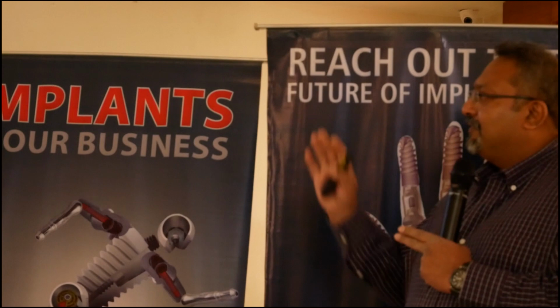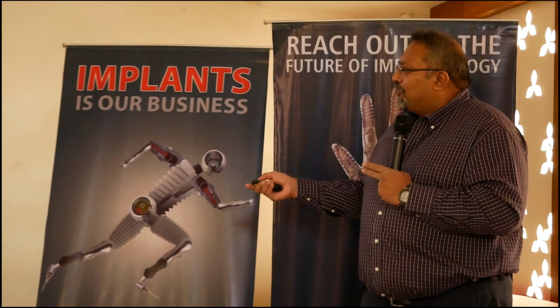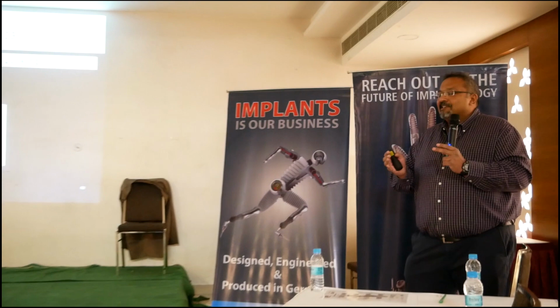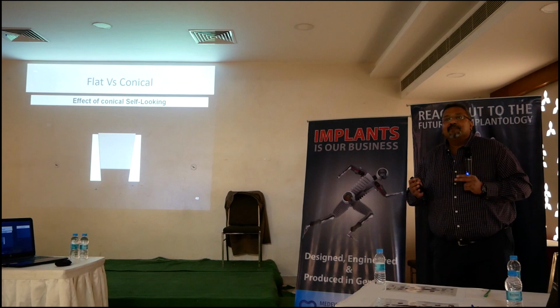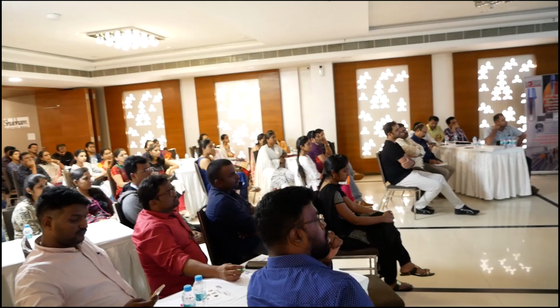Look at what happens when you have a conical connection. The abutment goes inside and in the process it deforms the implant a little bit, so that now there's a clamping force around the abutment. Whatever force is trying to pull it out is counteracted by this clamping force. We call that a cold weld, isn't it? A proper length of the conical surface should be long enough to cold weld properly and stay in place, right?